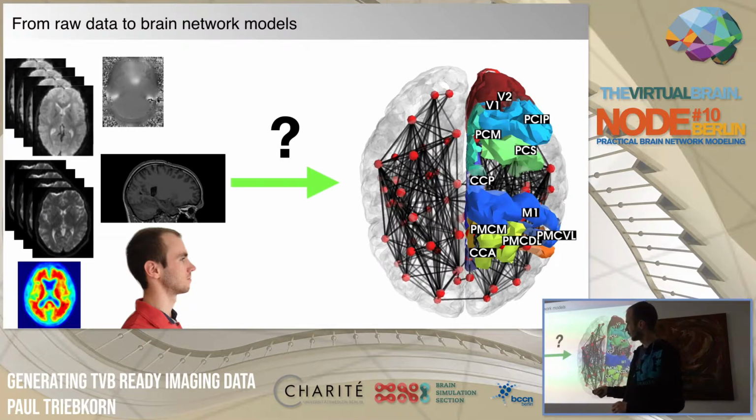And in some cases, we also use PET, positron emission tomography, for example, in Alzheimer's disease, tracing amyloid or tau proteins. So all these different modalities we want to combine into one model. Yeah? And what I want to show here is that all this data is individual, for a subject. But the rest is taken from my brain.